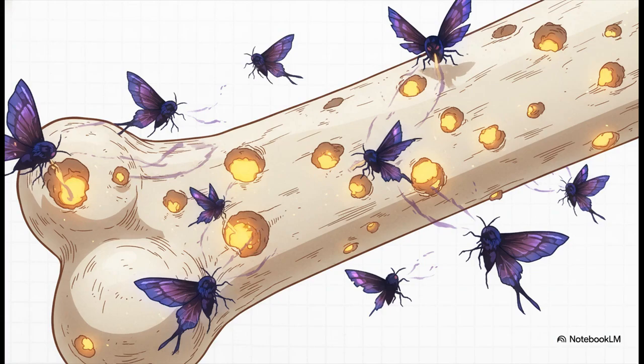Then things get a bit more concerning with the moth-eaten pattern, and it looks exactly like it sounds, like a moth has chewed a bunch of small holes in the bone. The source compares it to a spray of buckshot. This pattern is way more suspicious and suggests a tumor that's growing and spreading fast.